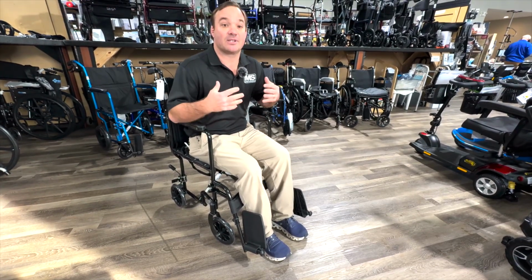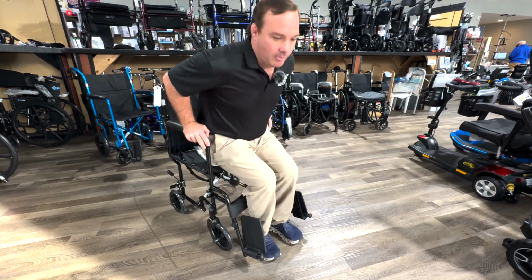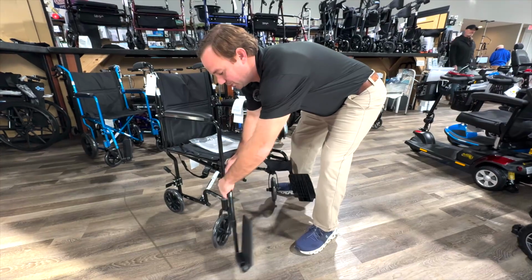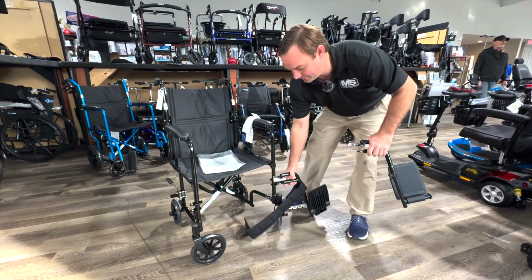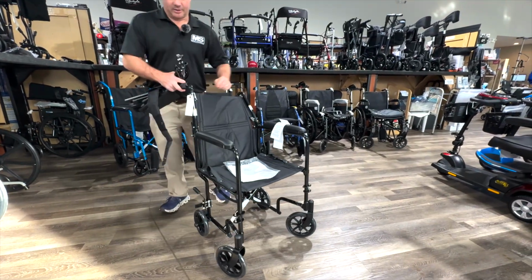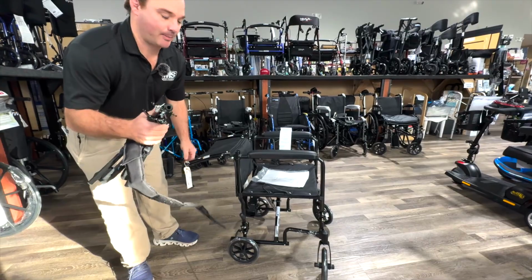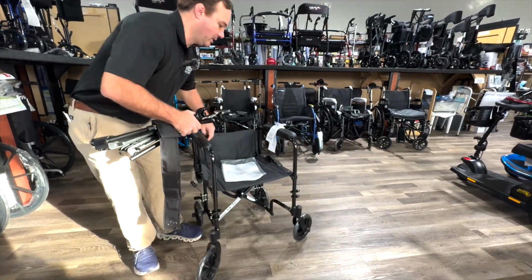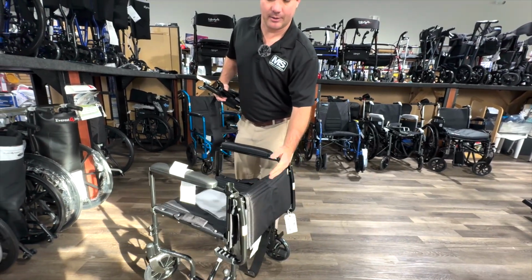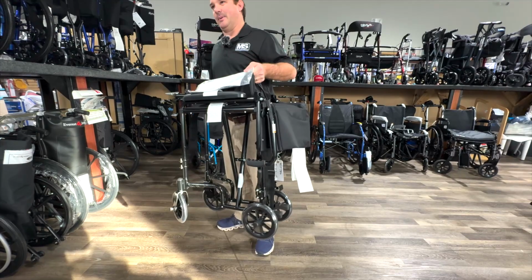So most times this is for someone taking someone to the doctor's office, making it lighter, because you can compact these things better than some wheelchairs. So that comes off, flip these off. It's going to be a bit more narrow because you don't have the big wheels on the side of it. I'm going to show you something that you can do too, and then you can pull this up. But see how that back folds down? That makes it a lot easier. And it's probably like 18 pounds.